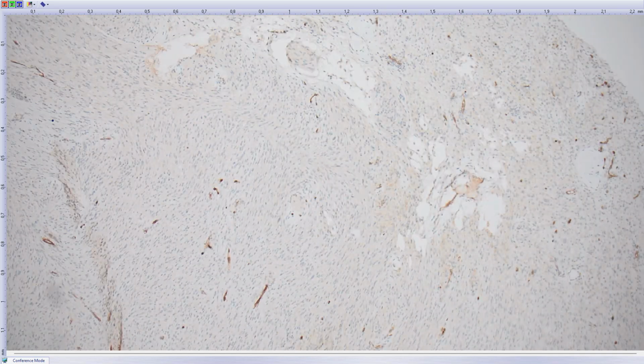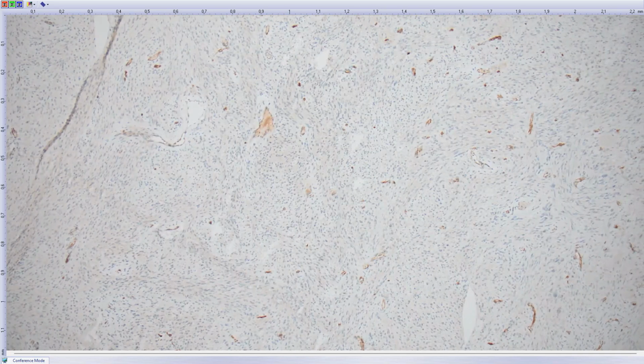Sometimes you can also find, they say 80%, my experience is worse, WT1 nuclear positivity, which is shown here, or the stain is here, but it's negative. So maybe we don't have the right clone, I don't know. So superficial CD34 positive fibroblastic tumor. Again, a tumor occurring in peripheral soft tissues, typically in younger patients, younger adults or teenagers. Most common location is the thigh.